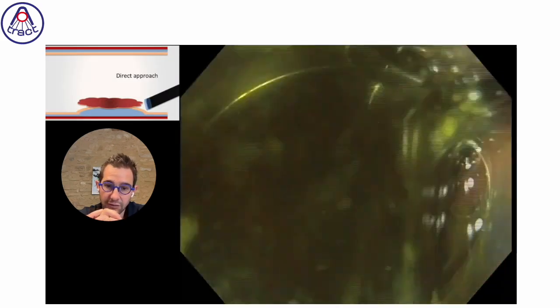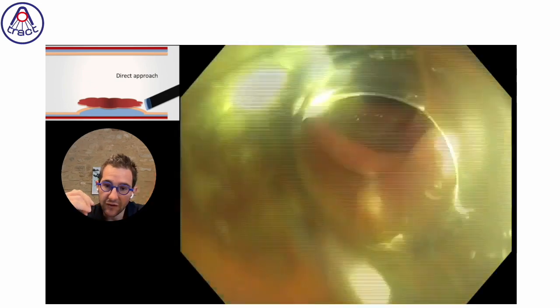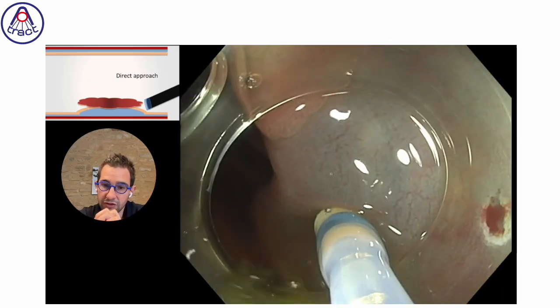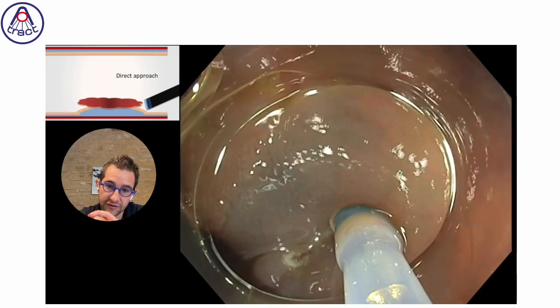At the same time, when I can, I remove water by suctioning in order to make the area more clear without all the liquid coming to the field. But here the gravity is not so bad. It's at the side of the lesion, not perfect, but relatively good.